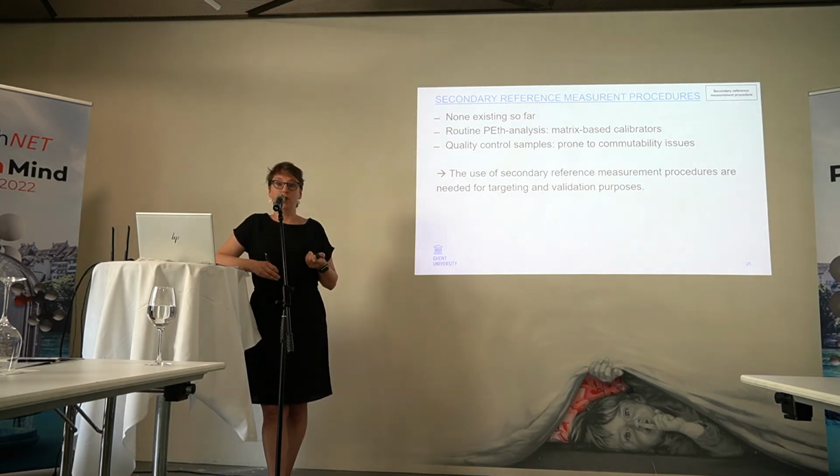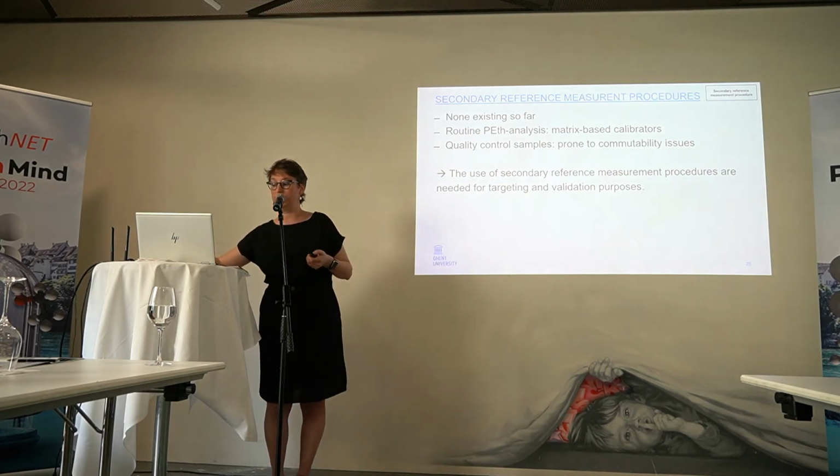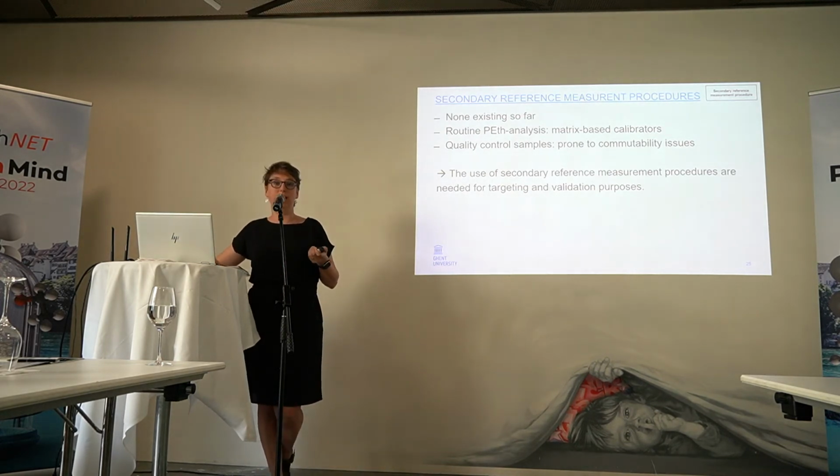The same for the quality control samples. Such a reference measurement procedure could actually be used to identify commutability issues. So, as said, the need is in the targeting and validation of what we do at the lower level.